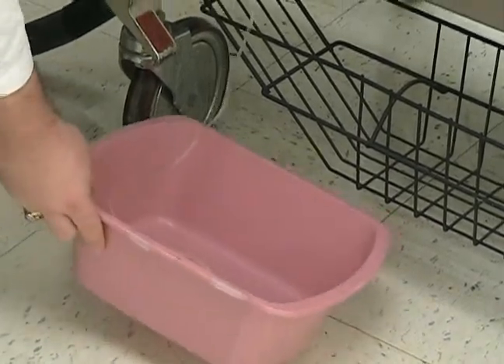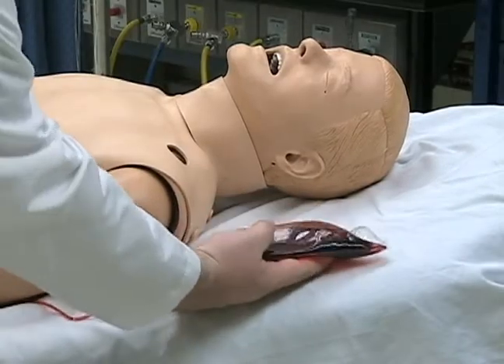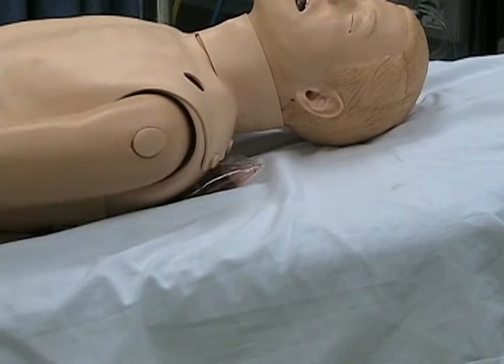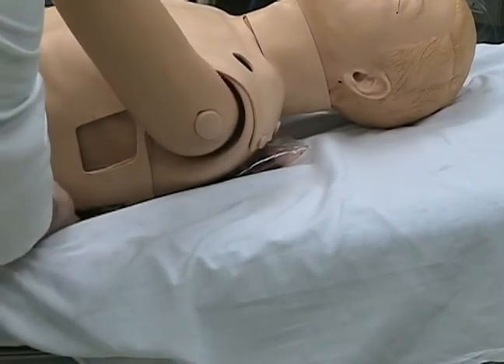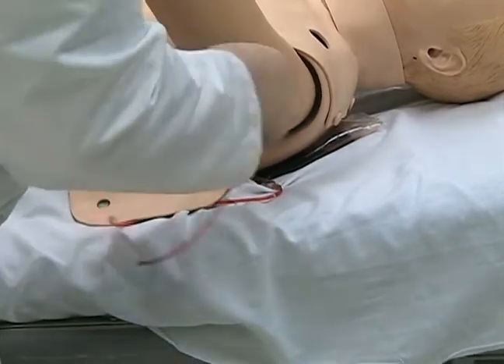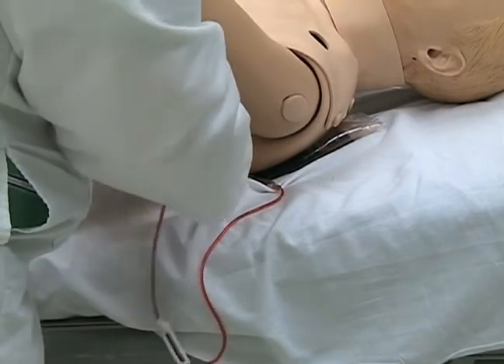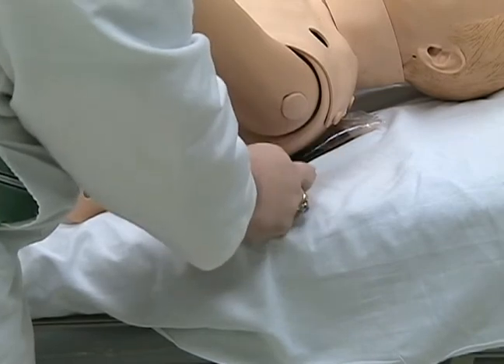Next we take our basin and stow it underneath the bed so it is out of the way during the simulation. Take your blood reservoir and place it underneath the left shoulder of the mannequin. The pressure from the mannequin will allow the blood to flow through the tubing. Through the side of the chest skin, you're going to insert the blood tubing. As you insert it, ensure that your roller clamp remains underneath the armpit of the mannequin. The tubing will be covered by the gown.